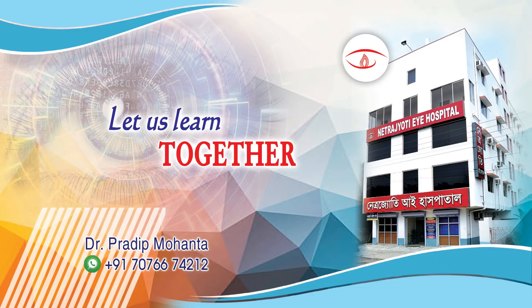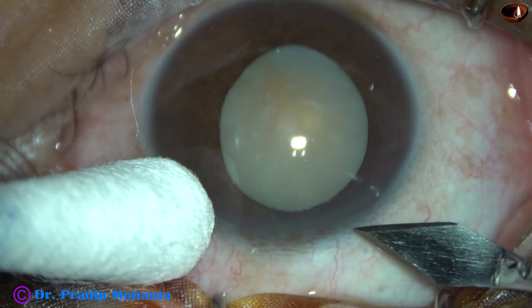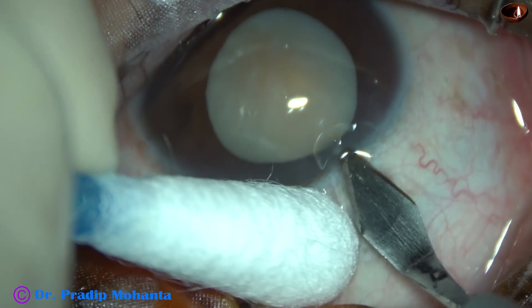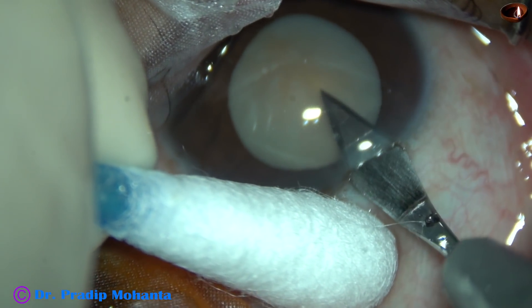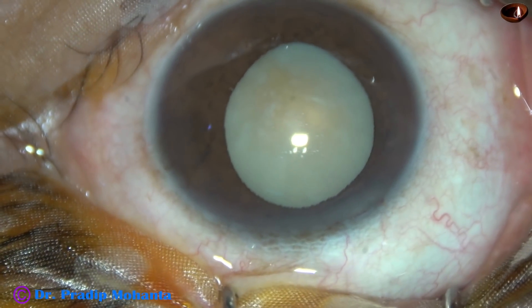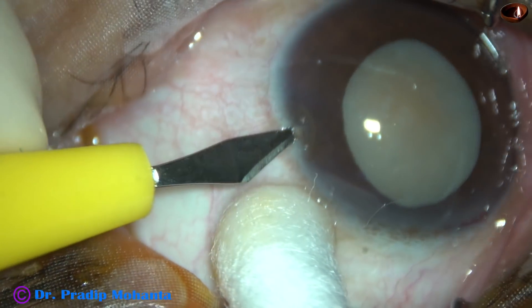Friends, welcome to my workplace at Ranaghat, West Bengal, India. This is a hypermature cataract. In some hypermature cataracts, the nucleus can't be divided into free fragments because of a stubborn leathery posterior plate. This is a case of that kind. Let us observe the surgery.